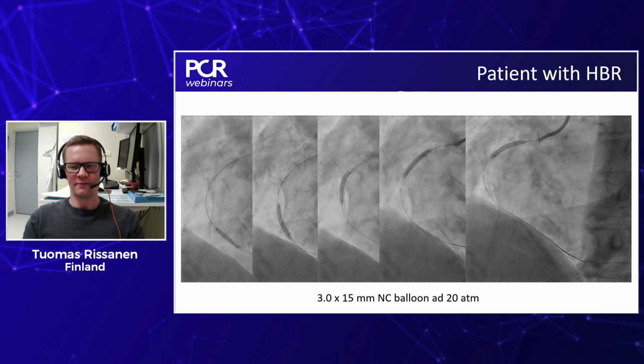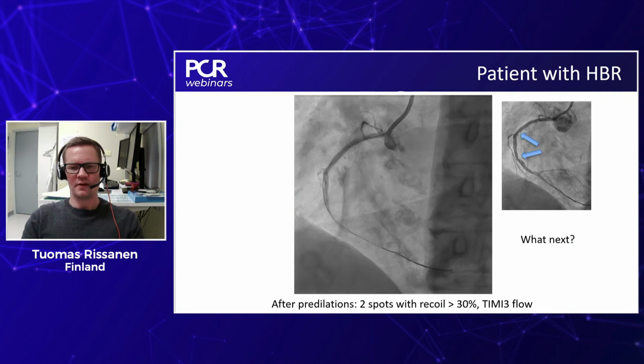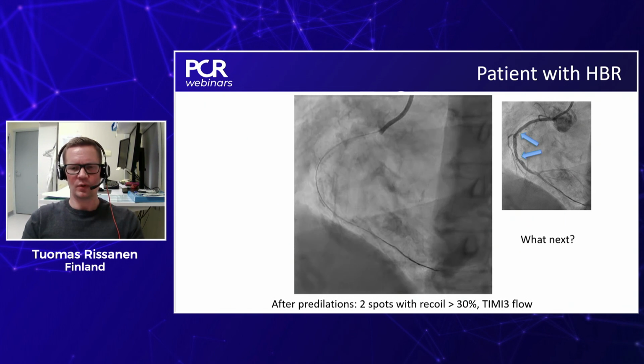Then if we are going to aim for the DCB, or at this point we don't know whether we have to stent the vessel or can approach a DCB only strategy, but anyhow we have to use a 1-to-1 ratio of balloons, and we almost always use non-compliant balloons, as long as possible, at high atmospheres, and also with long dilatation time to seal the dissections and have little recoil. And here you can see the result after predilatation with the non-compliant balloon.